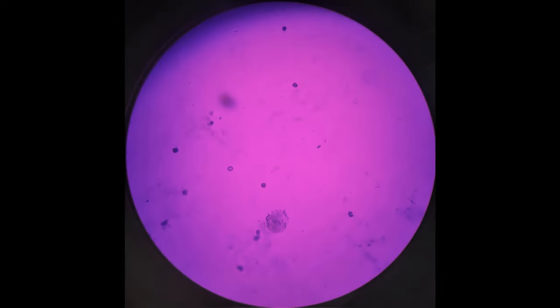This is how WBCs will appear on the counting grid under 40x. The nuclei are stained deep blue against a violet background.